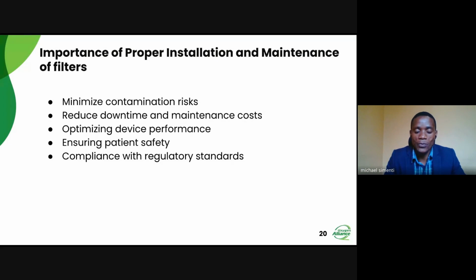So it is most important as engineers to make sure we follow the proper guidelines when we are installing these filters. We have full knowledge, and if we see that they need maintenance, we need to do it in time. By doing so, we are also able to optimize the device performance. It means the device will continuously be performing in good condition, therefore continuously delivering oxygen as a therapy to the patient. And by doing so, we are also ensuring the safety of the patient.